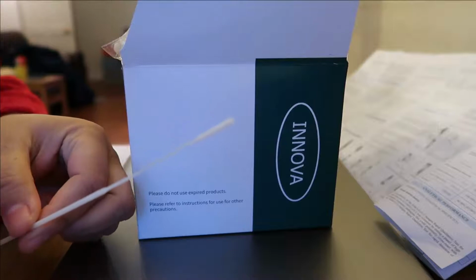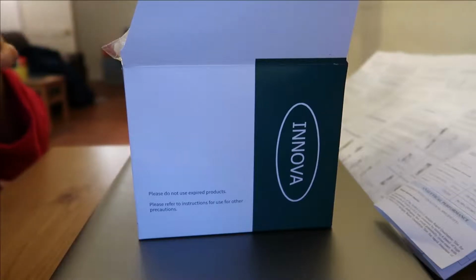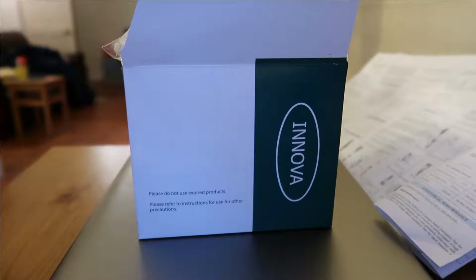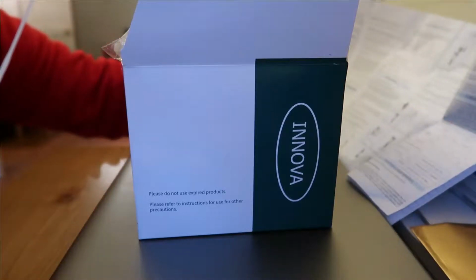This is very uncomfortable. Oh my goodness me. You should roll the swab 5 times to make sure that you are able to get all the necessary antigens. Oh my goodness, it's not really comfortable.